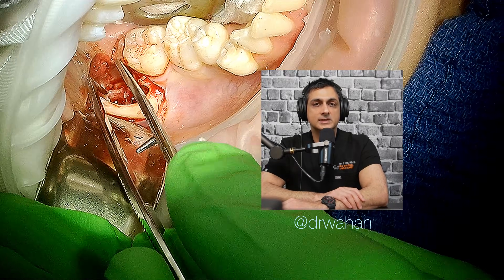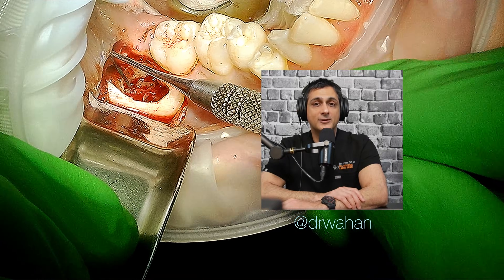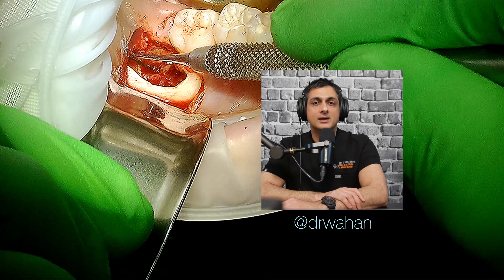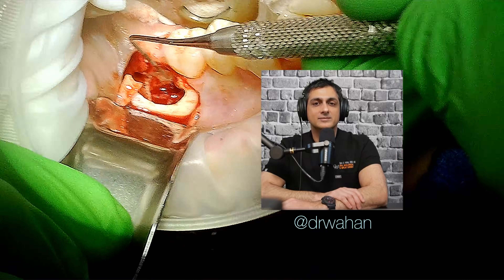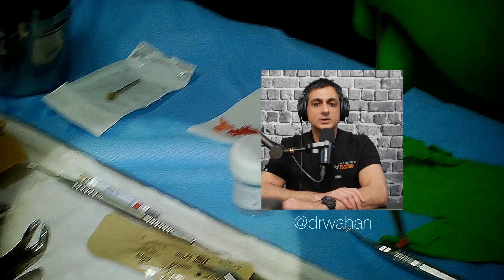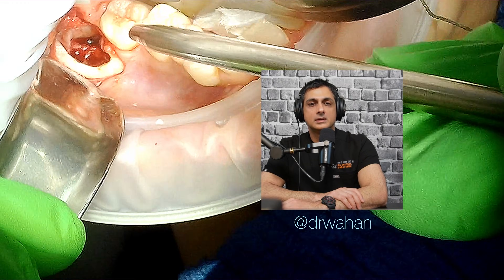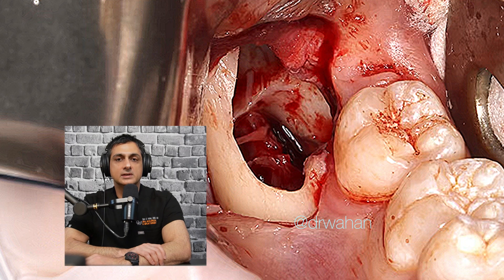I'm trying various instruments to grab it without displacing it further. I tried a periodontal probe — and what do you know, pop, it came out! Got lucky — I think that's the last root. Got that out and we're going to submit everything for path review. Cleaning everything out now. There's the nerve — good picture. It's hard to get a good picture of that area.